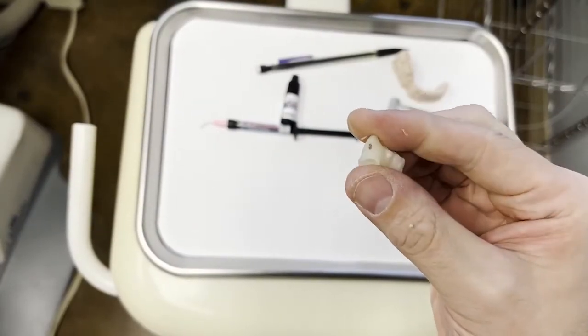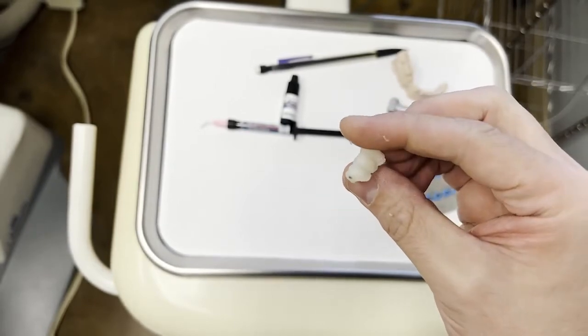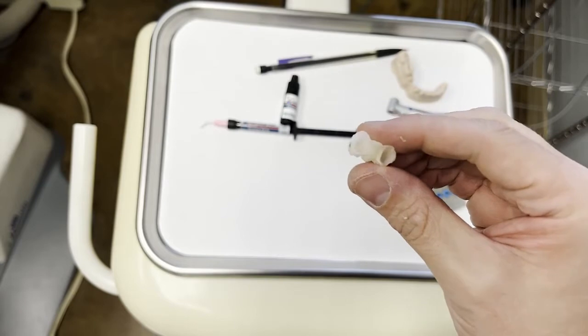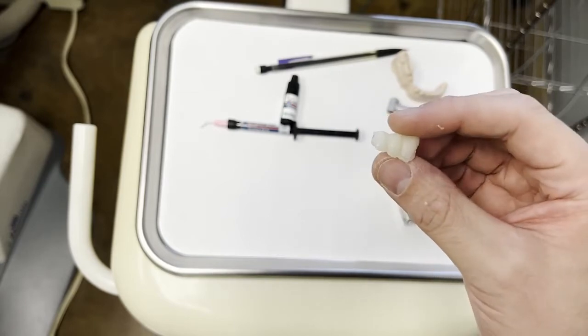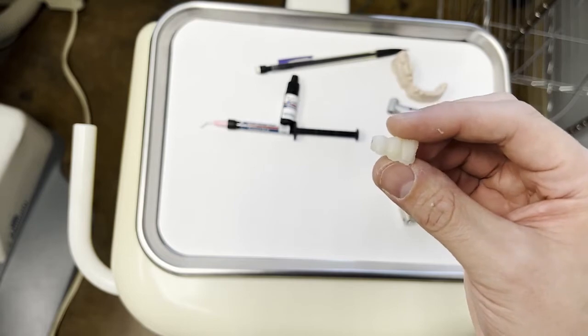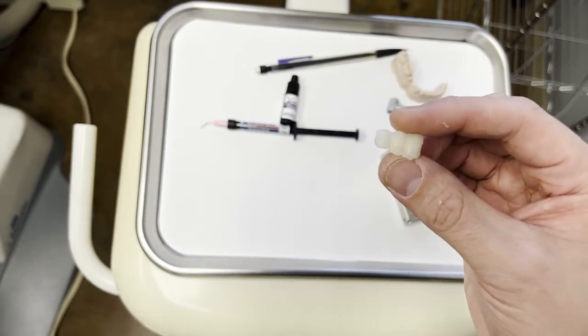So I can see a good amount of our flash is removed. We still have some to work with, but our interproximals are starting to take shape. Now we still have to work the facial here and we obviously have to work the interproximals from the abutments into the pontic. We're going to work on that now with that same burr, and then after that we will move on to our next step.